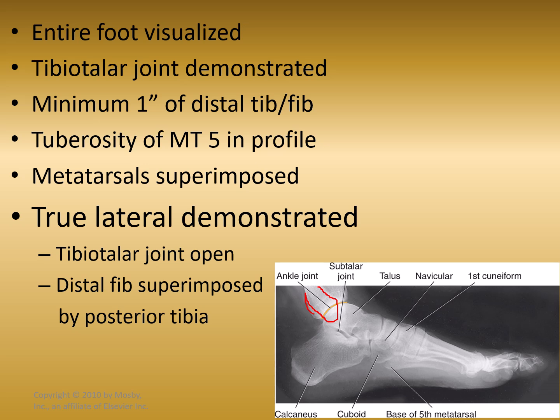Okay, and then also we're going to describe the calcaneus as being in profile. Calcaneus in profile.